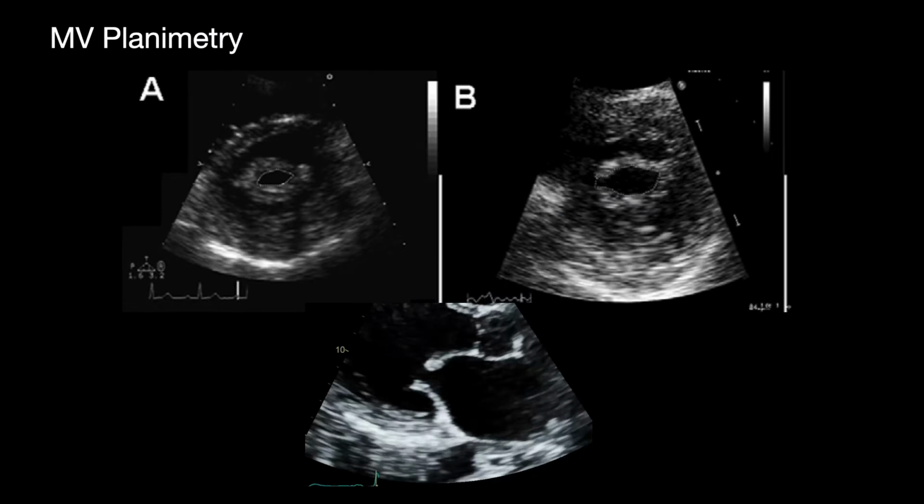In this view, you can also measure mitral valve area using 2D planimetry. And this forms part of assessment, particularly for mitral stenosis, which we'll talk about in a subsequent lecture. But just briefly, the optimal timing of the cardiac cycle to measure planimetry is in mid-diastole, when the valve is open and should be open at its greatest.